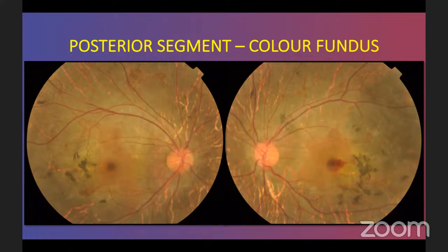For the screening part, I am not changing a lot. At every follow-up when they come, we usually do autofluorescence, OCT, and OCT angio if you have it. If there are no features of any CNVM development, we usually keep it yearly. And if they develop CNVM, because these are very subtle CNVMs and they respond very well, once they regress I usually call them every 4 months, and I do OCT angio to look for recurrence. Fluorescein angiography at baseline I do sometimes if I suspect CNVM, but otherwise I rarely do fluorescein angiography in these cases after the OCT angio has come.